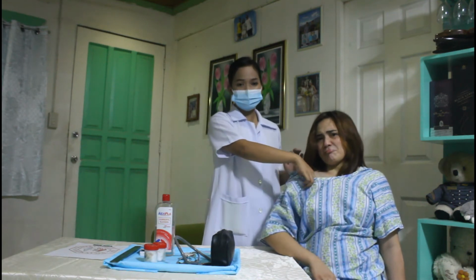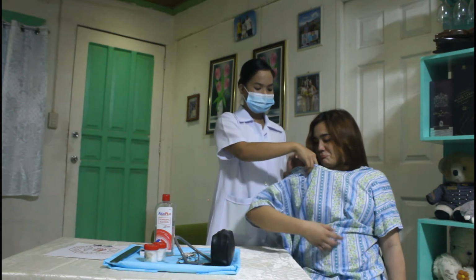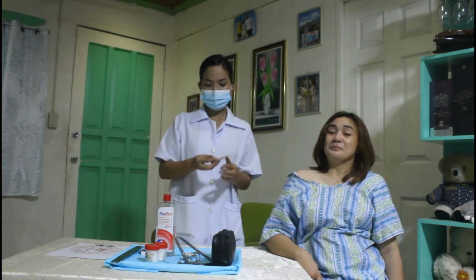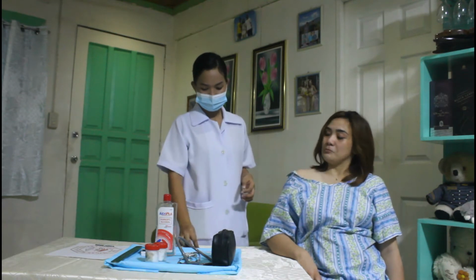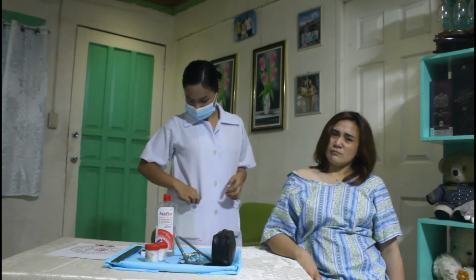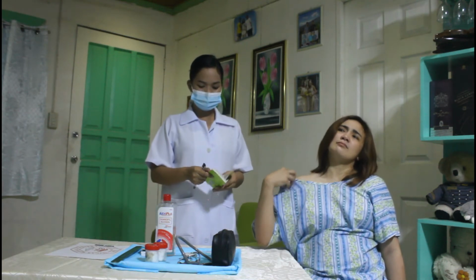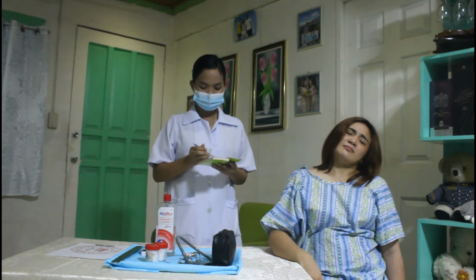So once we're done, we take note of the temperature of our patient.